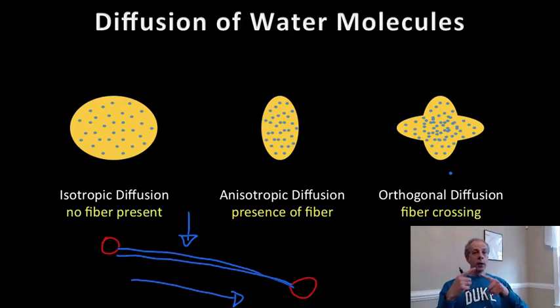Now you can also find crossings, basically find that more than one direction is difficult to make the water go through. And in general, you can find basically the probability of diffusion in every direction, and that gives you the probability of having connections, cables in the brain, these bundles in the brain between different directions. How is that done?